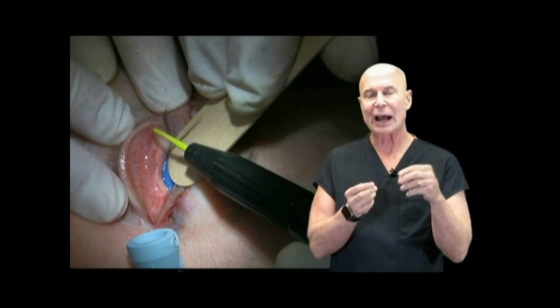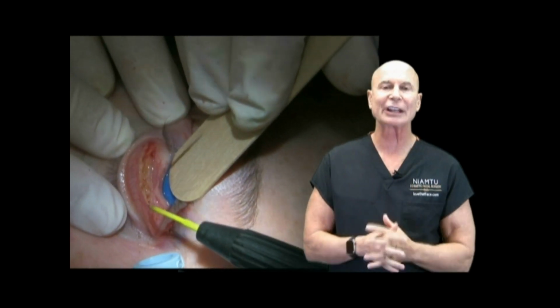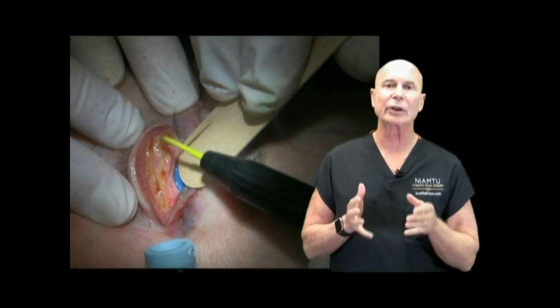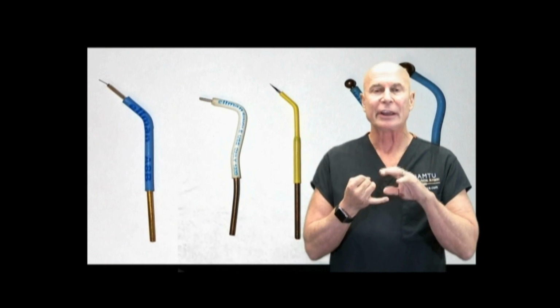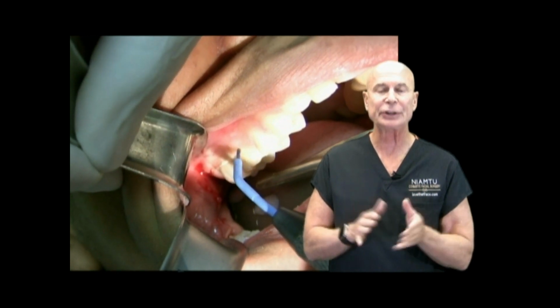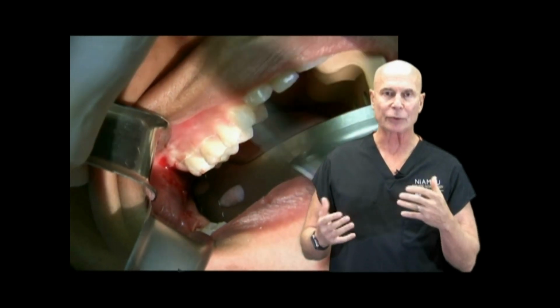The tip never gets hot, never gets red hot. It just does much less lateral thermal damage to the tissue. And so the basic advantages of radio wave surgery are that you have incision with hemostasis, you have less lateral tissue damage, so it's a bloodless incision that promotes better healing. Because you have very little bleeding, you have less bruising, less pain, faster recovery.